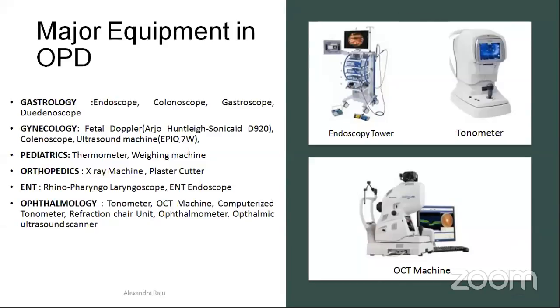And ophthalmology, which is related to the eye and defects of the eye, which we are monitoring. We have a tonometer, which measures intraocular pressure, and the OCT machine, which is an imaging modality to view the retina. The computerized tonometer is also there, along with the refraction chair unit. Ophthalmometer and ophthalmic ultrasound scanners are also present.